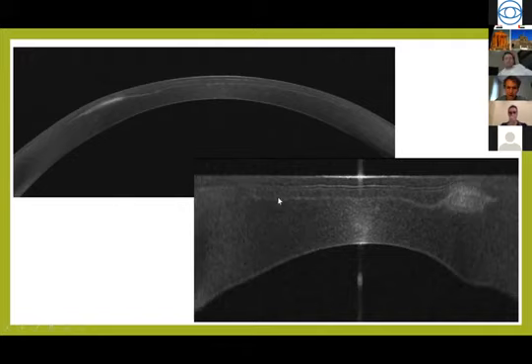Here you see how precisely the surgical plane is seen. And here you see again the compensatory effect of the epithelium, which is getting thinner in the area that is bulky, with some lysis of the overlying stroma. So what I did was just evacuate this lytic material, but being very careful because I knew that the overlying stroma was a bit lytic and probably affected by the epithelial ingrowth.